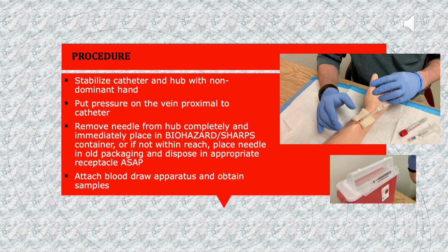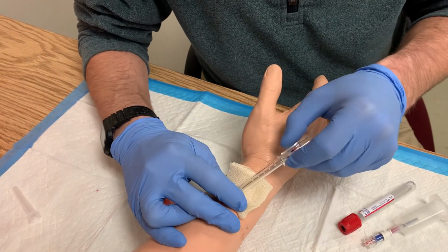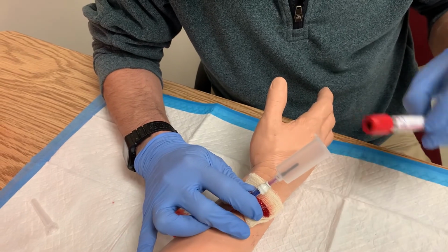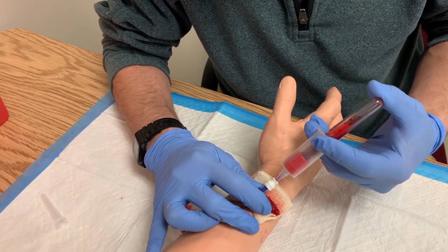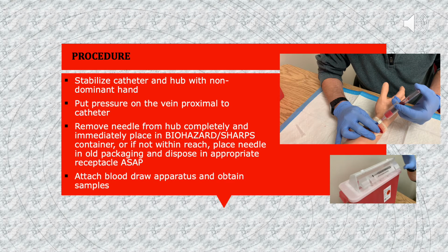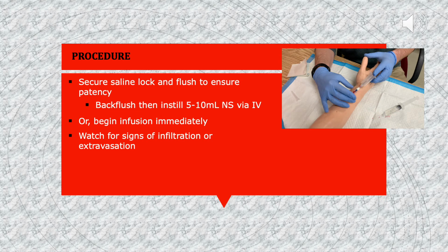Attach the blood drawing apparatus and obtain samples. Dispose of sharps appropriately. Secure the saline lock and flush the IV to ensure patency. Watch for signs of infiltration or extravasation, evidenced by significant pain, edema, swelling, or coolness to the vein just distal to the insertion site. Do not allow any blood to remain in the catheter, as it could clot and render the IV unusable.